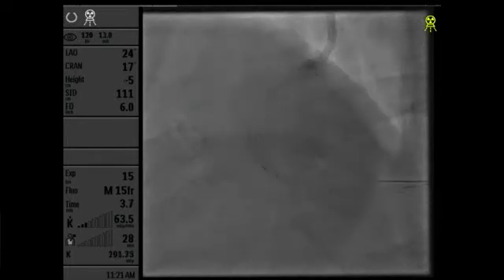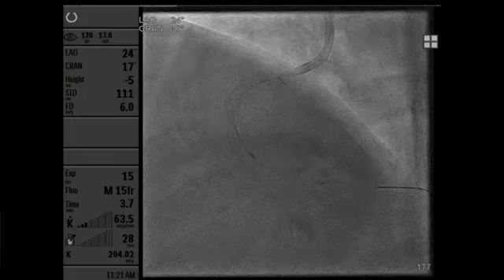Looks like you passed the... Yeah, I passed it for sure. Yeah. So the OCT, good. You see two markers. The marker in the middle is where the lens is, and that's where we're going to do the pullback. And we like the OCT also.